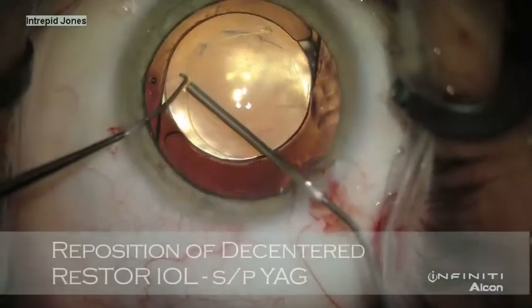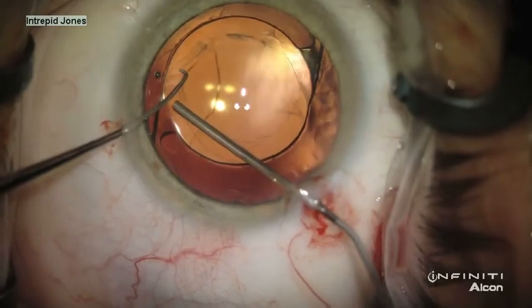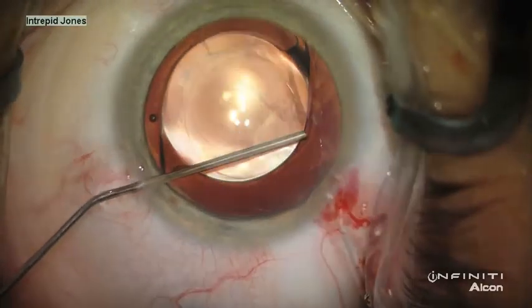In this last challenging case, an engineer has undergone restore implantation as well as YAG capsulotomy several months post-operatively. Unfortunately, his lens is decentered and he has significant complaints of glare.